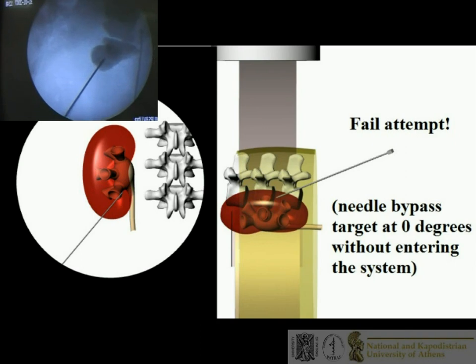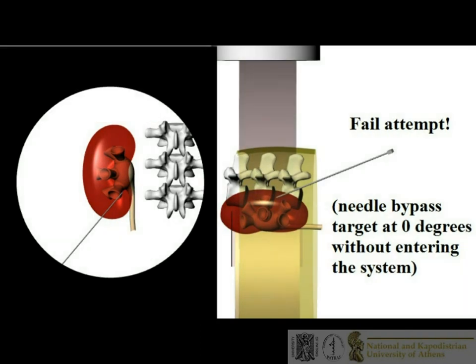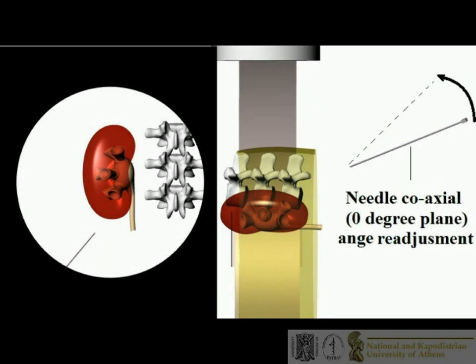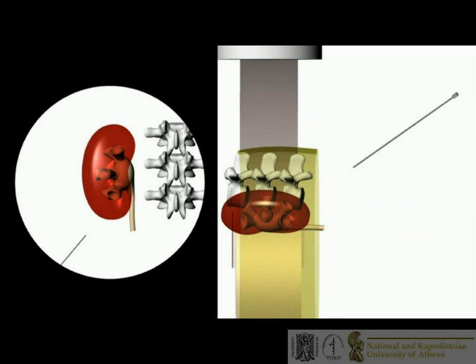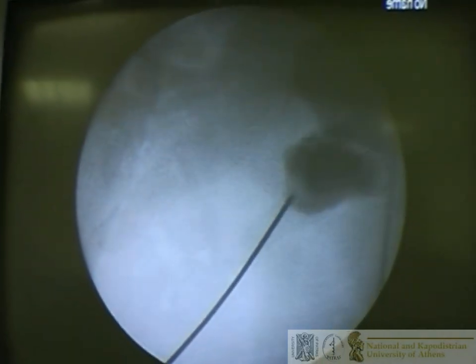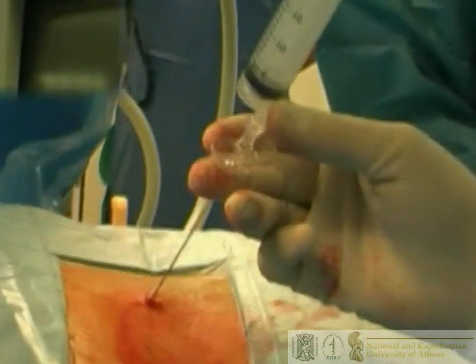Failure to access the calyx is recognized when the tip of the needle bypasses the target in fluoroscopic view without entering the system. The needle is then retrieved a few centimeters and its inclination is altered — more deeply or superficially — followed by a new attempt. The ability of the needle to move the calyx while in contact verifies that the correct depth has been achieved.